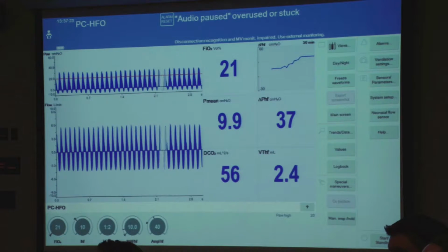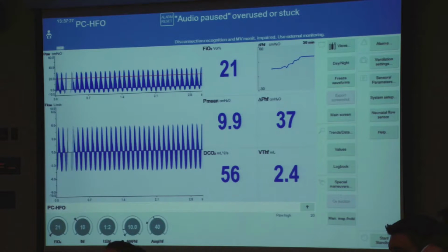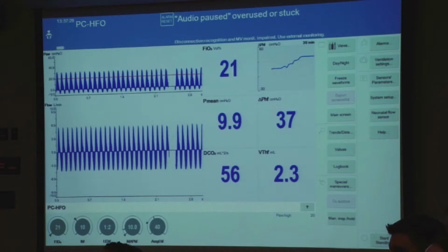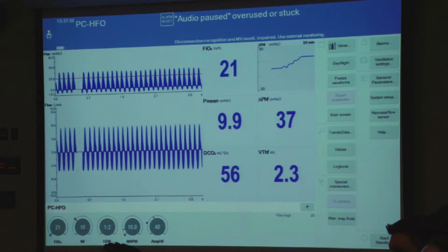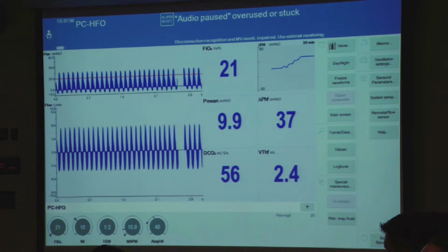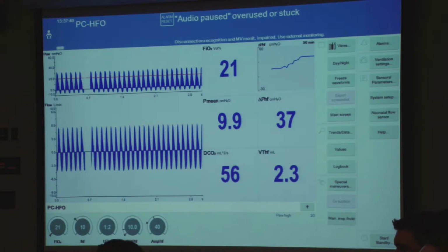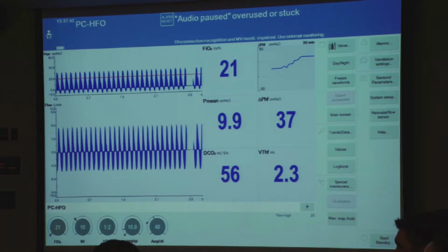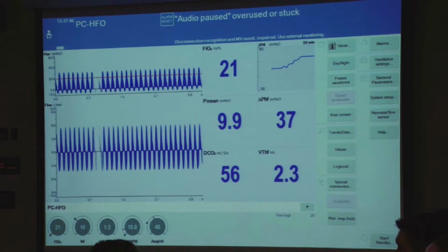What is the range of this? So we're not, in our system, going to touch the frequency. We're going to keep it at 10, but you said you do alter it. So how low do you go, and what's the maximum VTHF that you can accomplish? So do you go to 8 or 5? Generally, we don't go above 3.5 per kilo, but it will depend.